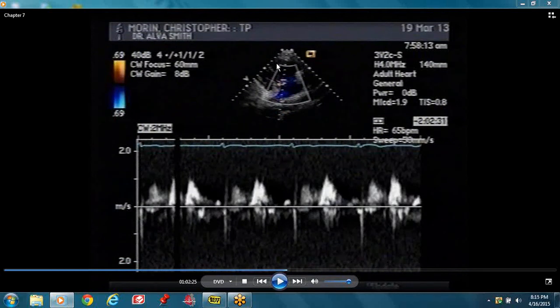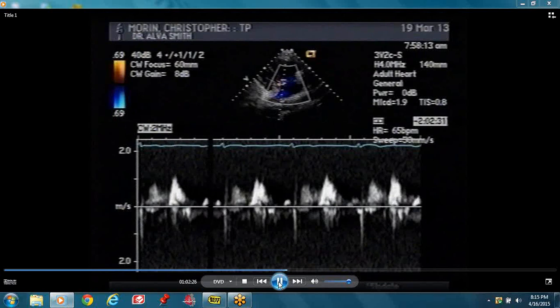Your cursor is across the tricuspid valve. This is actually an artifact.